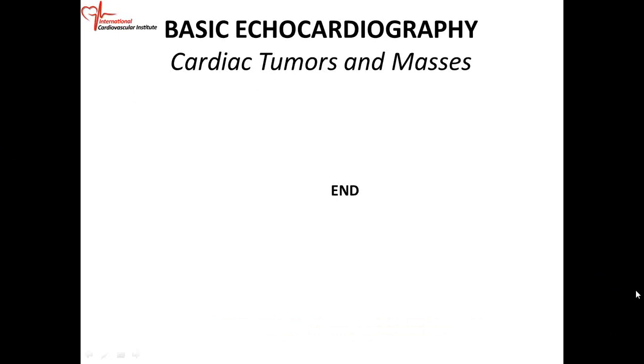But of course, every day you're gonna see pacemaker leads, so you have to know that's the pacemaker lead. You see catheters in the heart, the eustachian valve. Don't see the eustachian valve and diagnose tumors and stuff like that. So remember the eustachian valve and your lipomatous hypertrophy of the atrial septum. For exams, you'll probably never see a case of that, but it's classic, so they'll bring it on the exams.